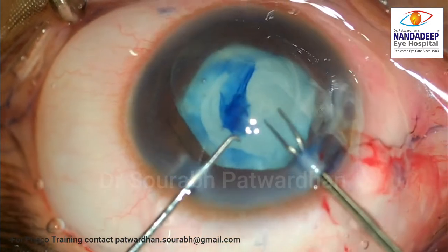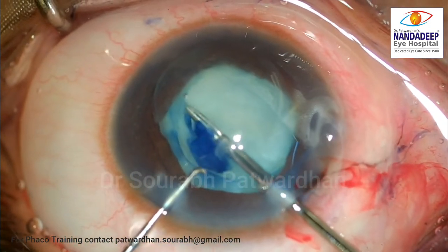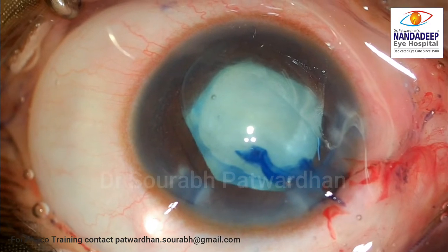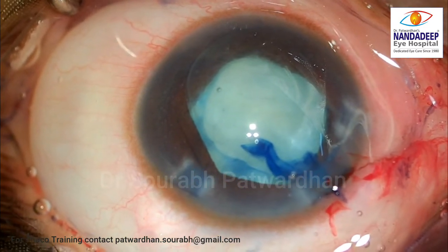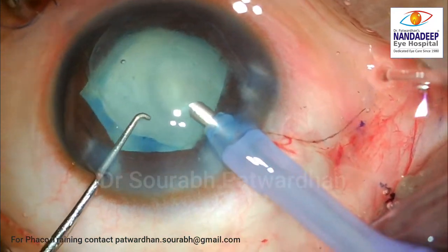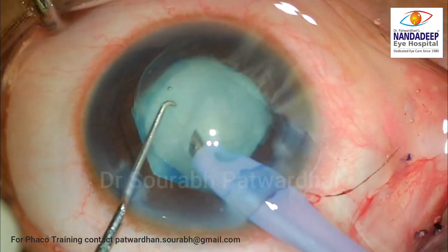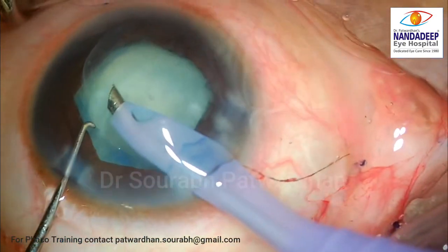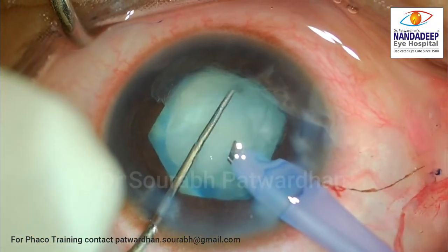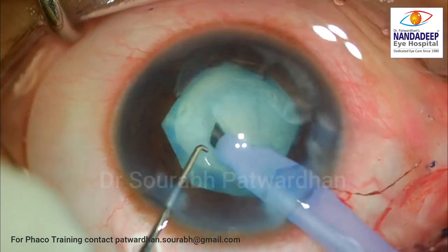That is why I try to move the capsulorrhexis steer tangentially as far as possible — that avoids the chances of zonular weakness becoming worse and causing subluxation. The capsulorrhexis was successful and I could achieve a good size. I will be going ahead with phacoemulsification. I have kept the exposed phaco tip a little bit smaller in size — normally I use a 1 mm exposed tip, but here it is around 0.5 to 0.75 mm, because in a shallow anterior chamber the irrigation sleeve might not enter the anterior chamber completely if the tip is exposed more.